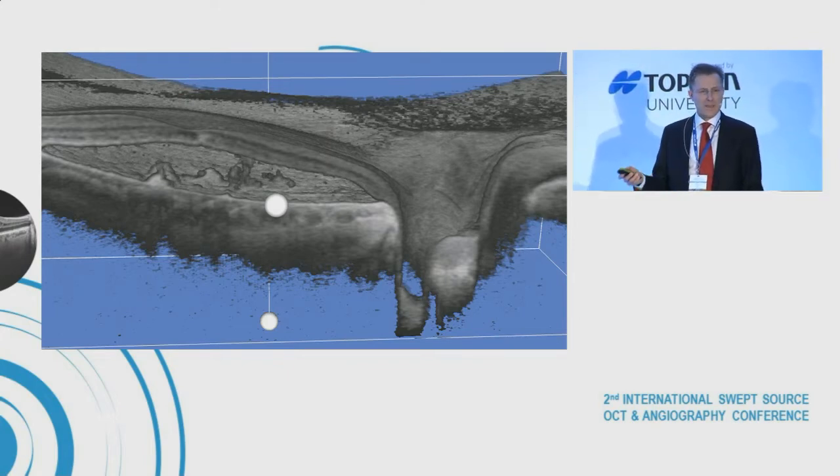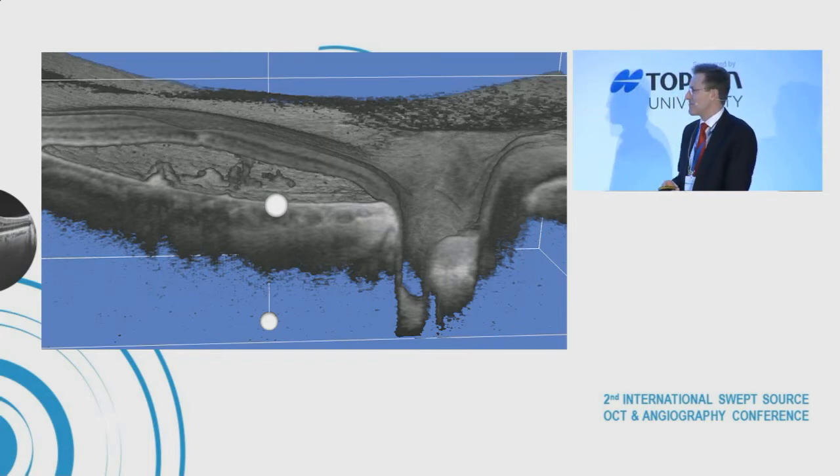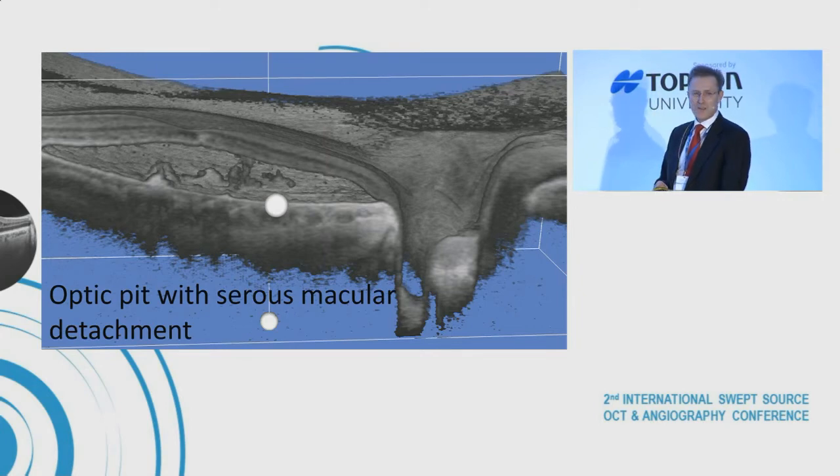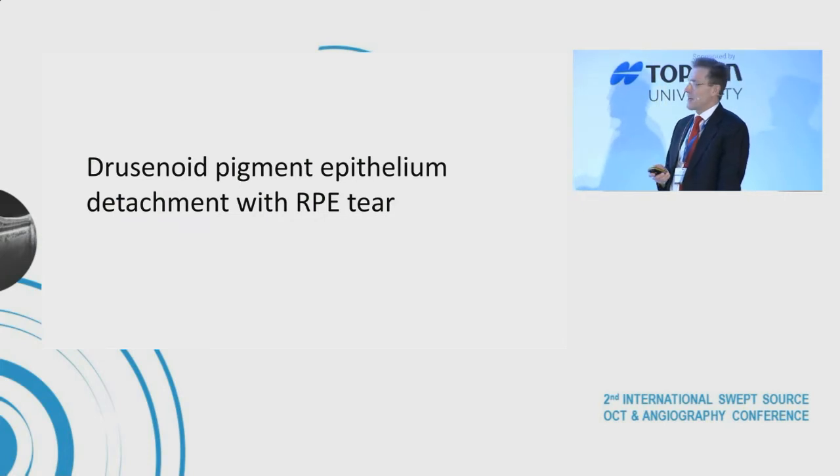And I think the problem with OCT, as Professor Drexler also showed, is that it's developing so fast that we don't have time enough to learn all the wonderful things you can actually do with it before you have the next generation of instruments. So I encourage my residents to do OCT themselves, because nurses are never going to figure out the mysteries of the retina that you can actually unravel with this beautiful instrument.